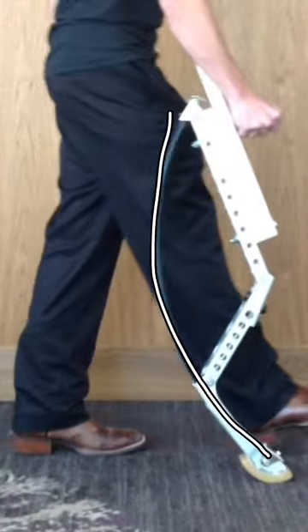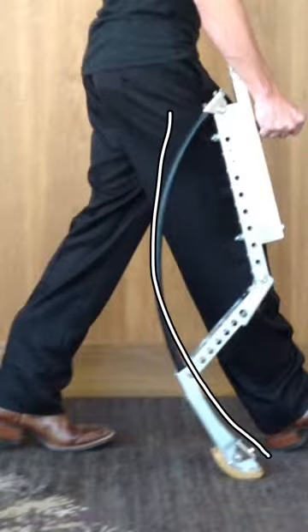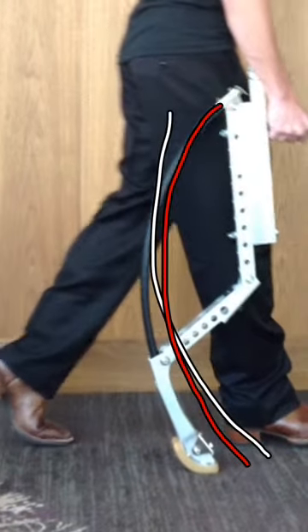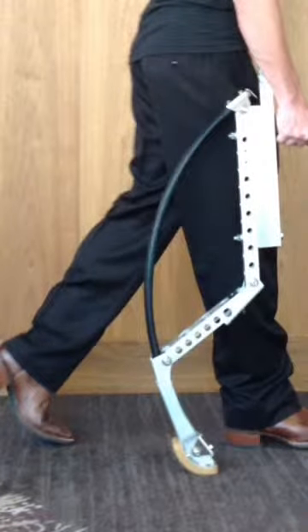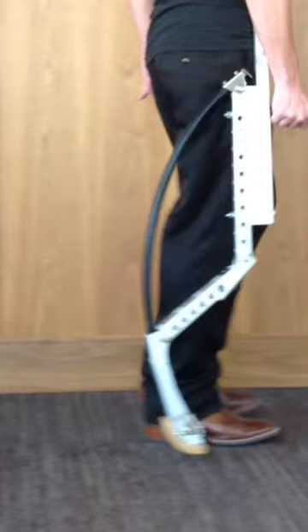As the weight is added right here, you can see the change in the arc due to the weight that is put on the spring. And as the weight is released right here, you can see the spring lose its compression.